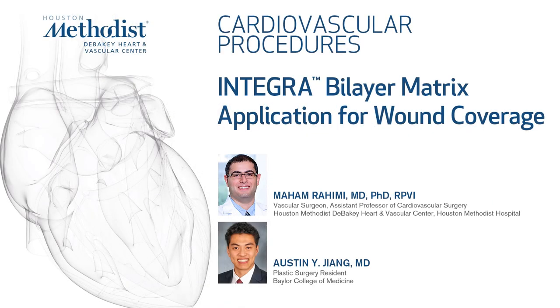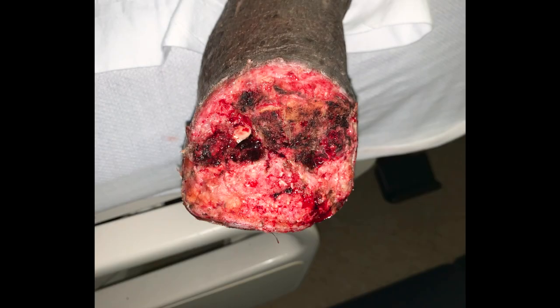Here we have a previously non-healing TMA wound that has received multiple debridements prior to final debridement and Integra coverage. The ideal wound bed is clean, contains healthy granulation tissue, and is hemostatic.